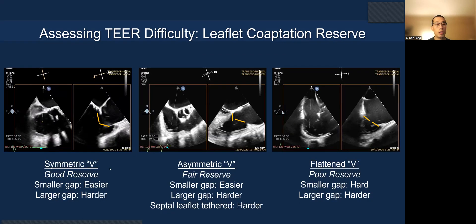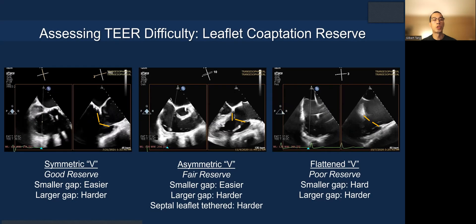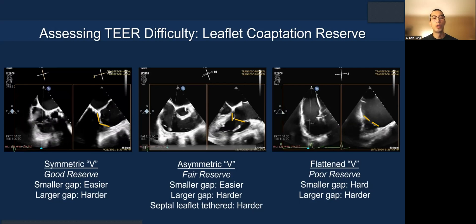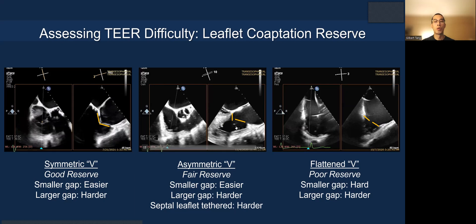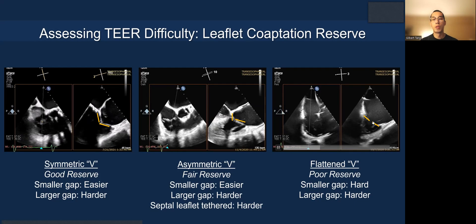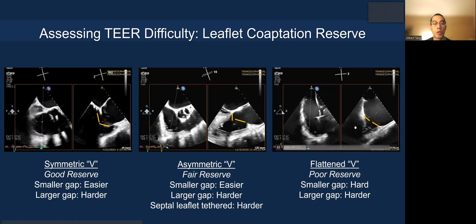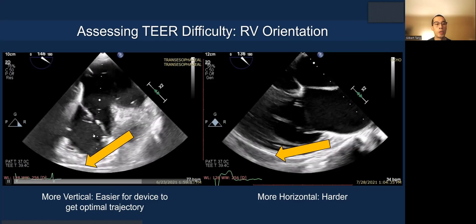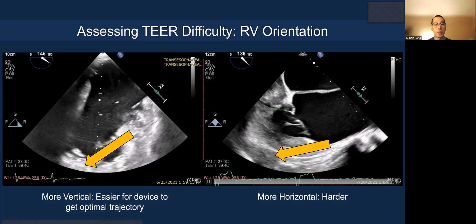Here is an example of coaptation reserve. A symmetric V-shape, like in mitral, means it is very easy for the clip to come up on the same plane as the leaflet — you just drop the grippers and close the clip. When the septal leaflet is more tethered, you almost have to do a hook, an opposite septal hook, to bring it to the anterior leaflet so they close together. And the flattened V has very poor coaptation reserve — even if you try to grasp, you may have to do so independently because you cannot open the clip to 180 degrees and drop the grippers, which only go down to about 120 degrees. A more horizontal right ventricle can also impact deliverability and ease of implant.